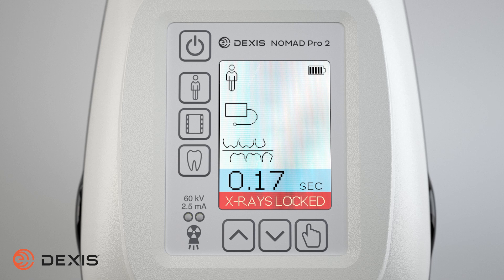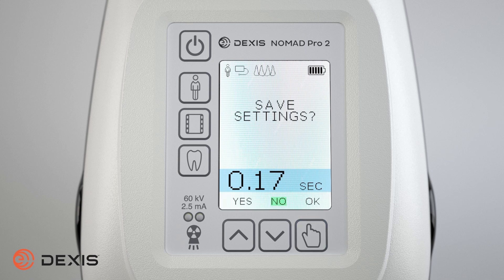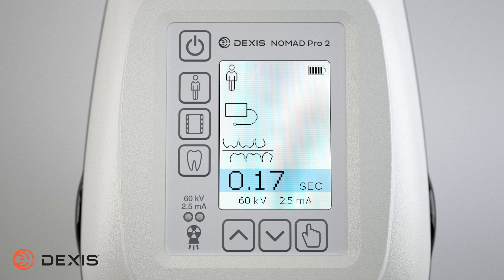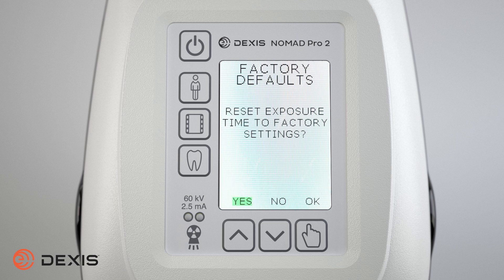When you've selected your desired settings and exposure time, press and release the select button to activate the save menu. Select yes by pressing the increase button or no by pressing the decrease button. Press the select button to choose OK. Once saved, this change will be saved until it is overwritten or until the factory default settings are restored through the reset default menu items. This change will stay in effect even if the device is turned off or the battery is removed.